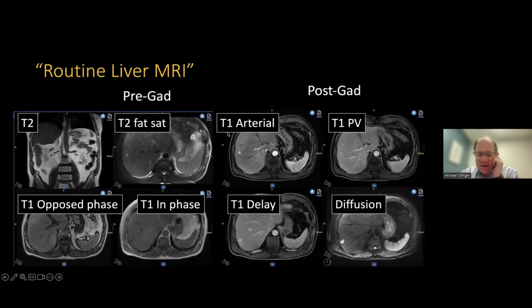One of the key takeaways, I think, is that we can actually see a lot on a regular CT. CT doesn't get a lot of respect, but the key is that pancreas protocol CT is for when there's a high suspicion for pancreas cancer. Otherwise you're for the most part giving extra radiation for not much benefit.